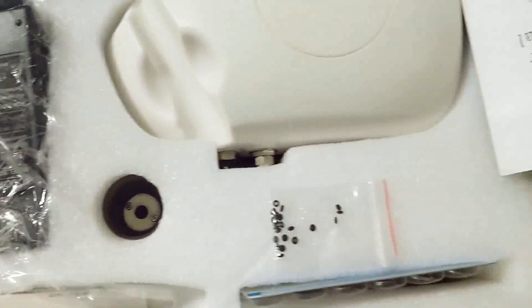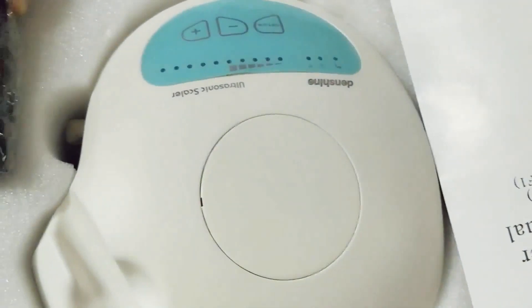Before using, please ensure that the handpiece and the tips are sterilized.